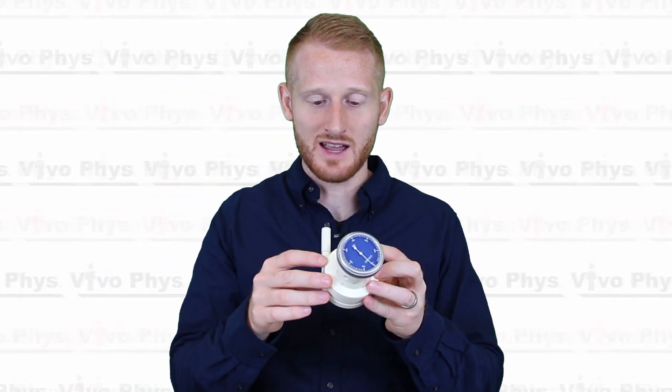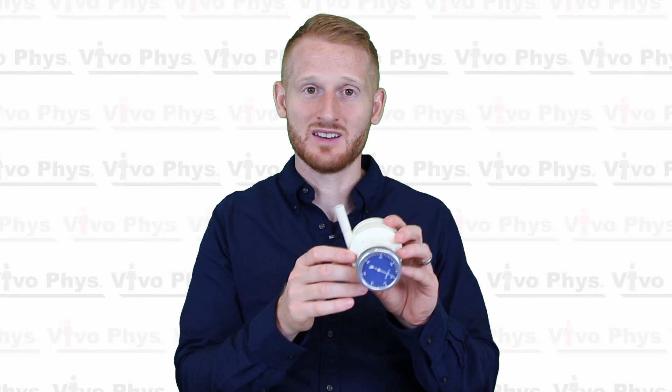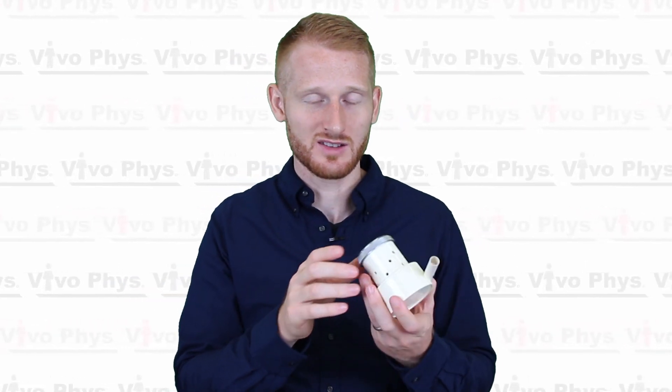You just slide this on and get a slight compression down to make sure it's on there snugly. Then all you're going to do is blow into that tube as hard as you can, as fast as you can, for as long as you can.